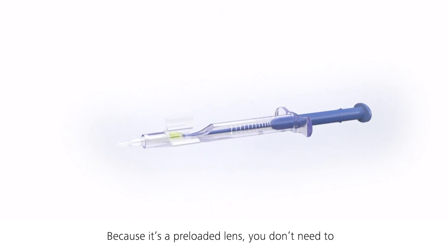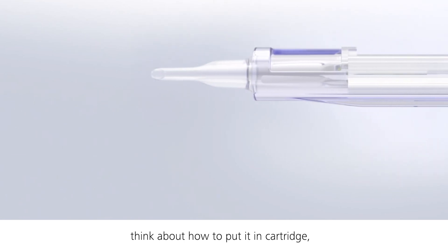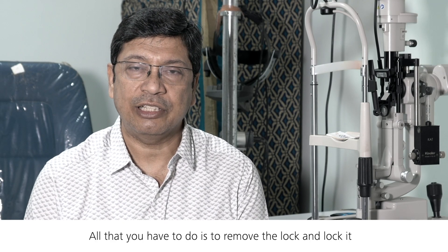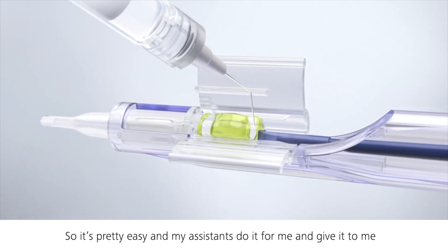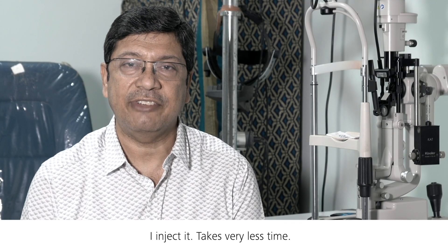Because it's a pre-loaded lens, you don't need to think about how to put it in the cartridge or how to fold it — it's already loaded. All you have to do is remove the lock, inject viscoelastic, and push it in. My assistants do it for me and hand it to me; I inject it. It takes very little time.